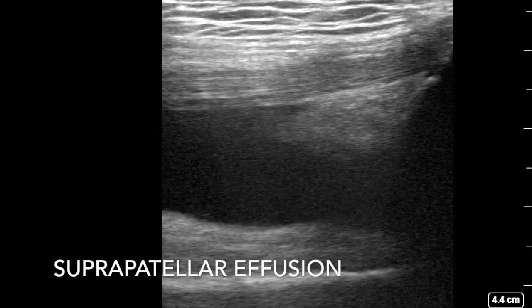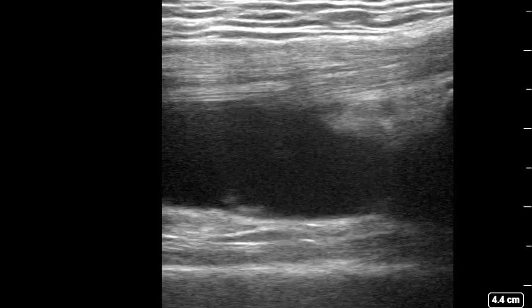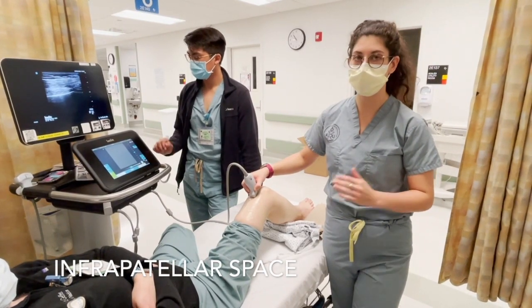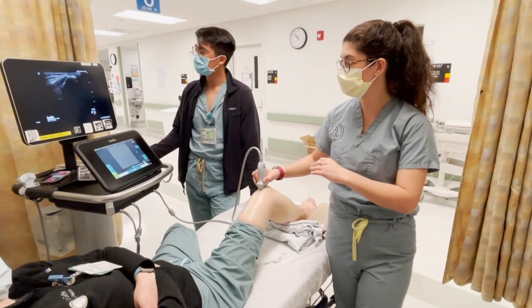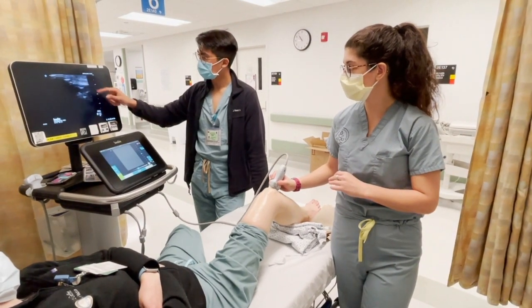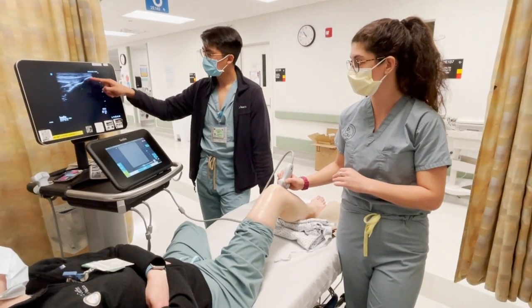In this suprapatellar effusion, you can see the quadriceps tendon and the two fat pads, but there's a large anechoic fluid collection between both of them. Now we're going to take a look at the infrapatellar space. As we do this, we're going to follow the quadriceps tendon up and over the patella as it becomes the patellar tendon, and we can even watch it connect to the tibial tuberosity.